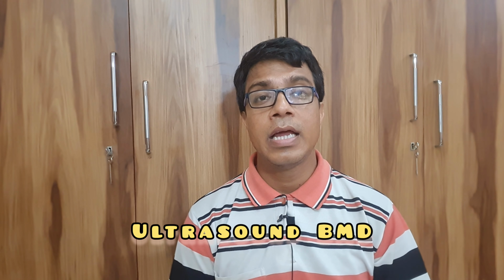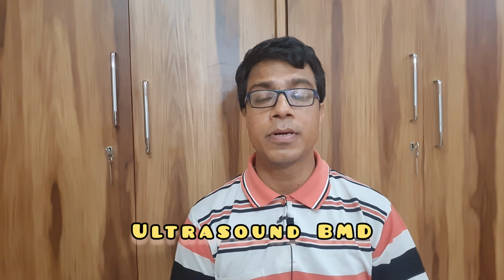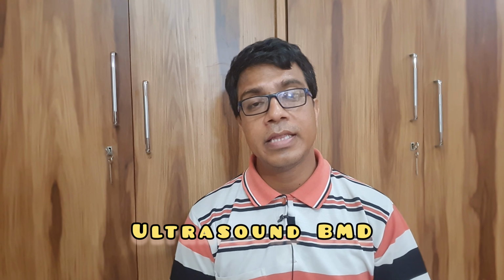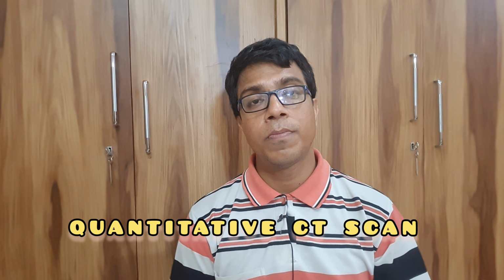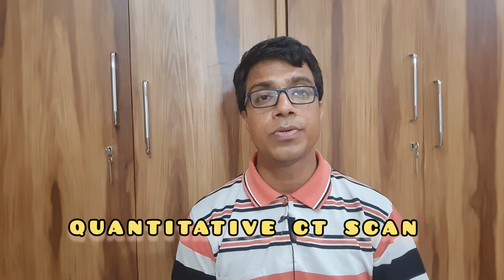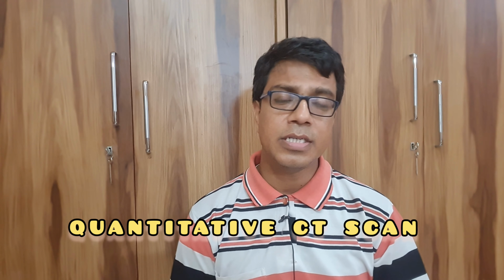There are some other methods as well. Doing a plain X-ray. Ultrasound BMD, or ultrasound bone mineral density, is a very commonly performed test in communities when we do camps to test bone mineral density in many persons or a population. Ultrasound BMD is a very cost-effective tool to screen osteoporosis in a population. There is also quantitative CT examination, a CT bone mineral density test, by which we can also determine the bone mineral density of a particular person. So this is how we diagnose osteoporosis.